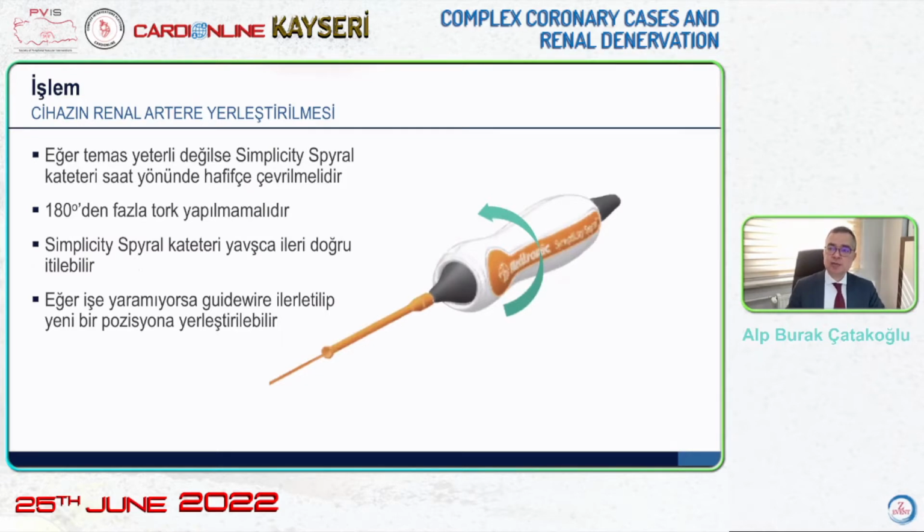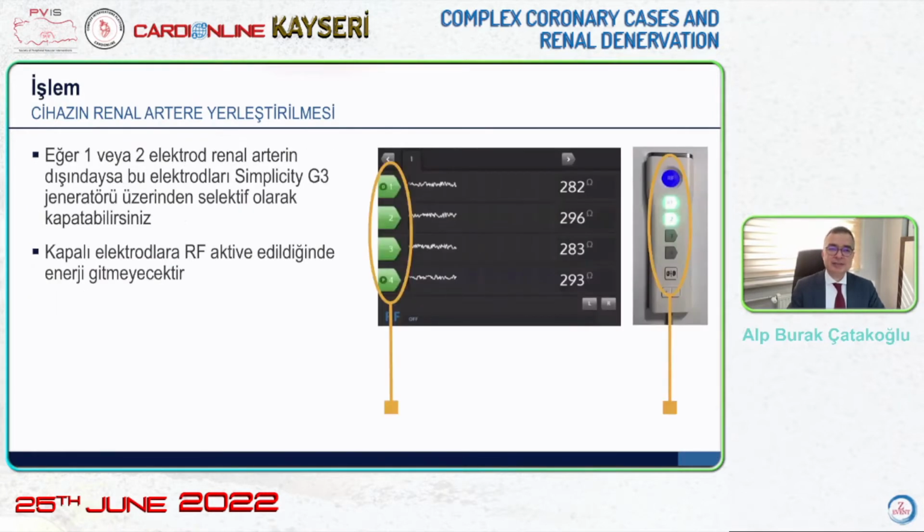But if you want more movement, and if you want to take it more upwards and downwards, you can use guide wire support, and push it to this, and you can position it. But the small movements can be done with the clockwise rotation.